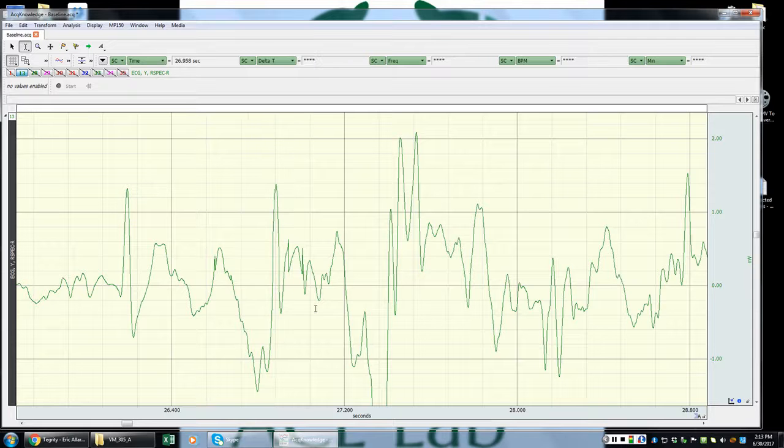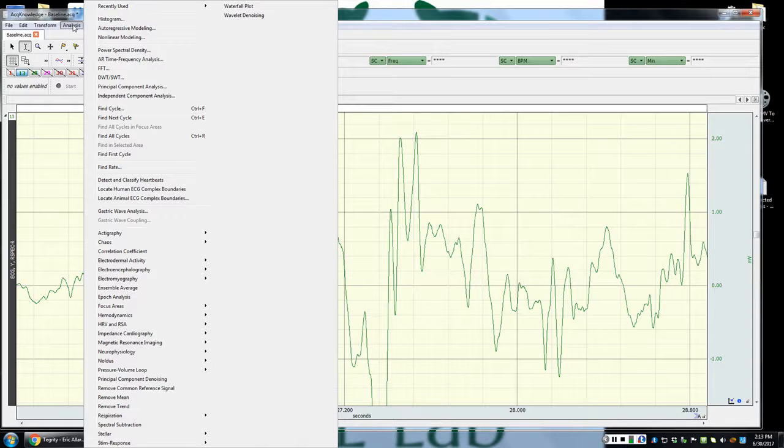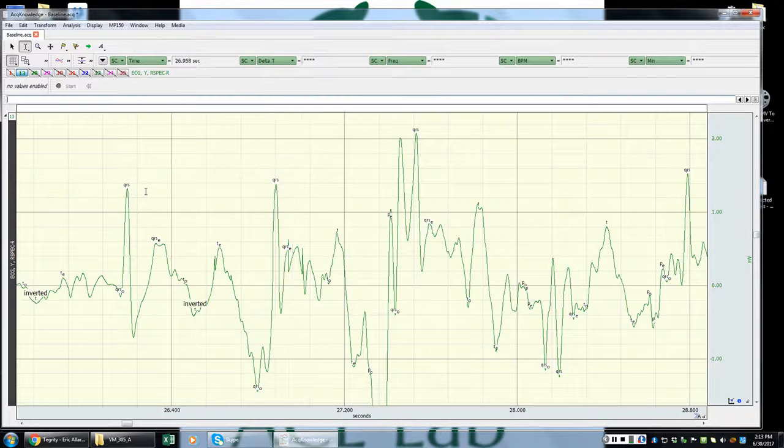All right, so now what I want to see is, is this going to be identified as a QRS peak in Acknowledge. Okay, so I'm going to go now to Analysis, Locate Human ECG Complex Boundaries. And it appears that that's the case. All right, so the QRS here, perfect. That's what I want to see.